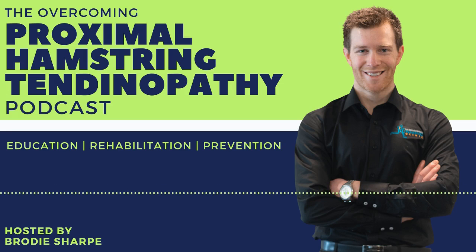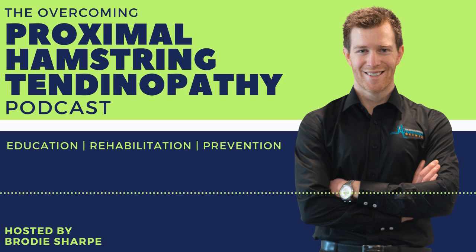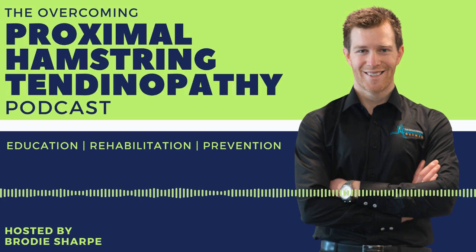That's number one. The number 2 reason things don't improve is because it's not given at the right stage. They have been given it too sore. They're already very sore, so you make them worse by giving them Shockwave. And the third and the most important thing is they have not had the rehab. They didn't have the rehab for 12 weeks after.